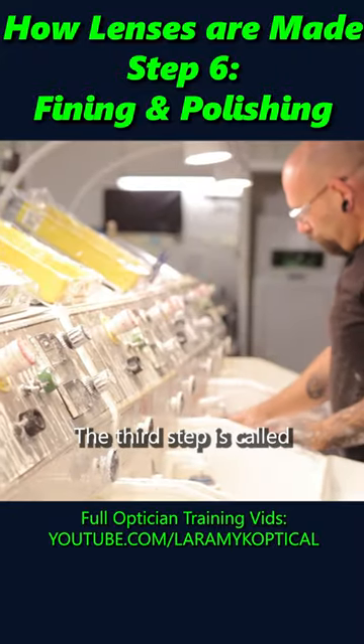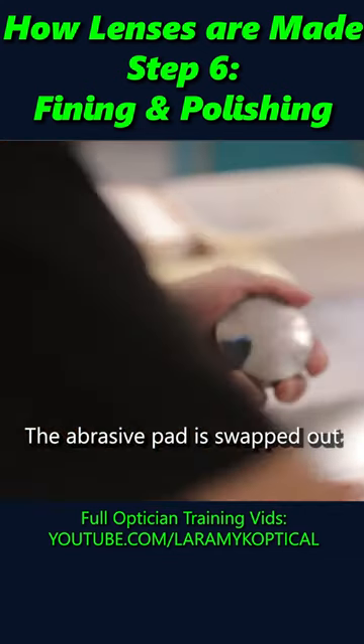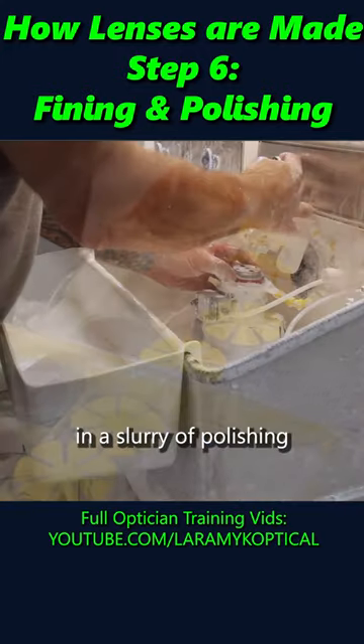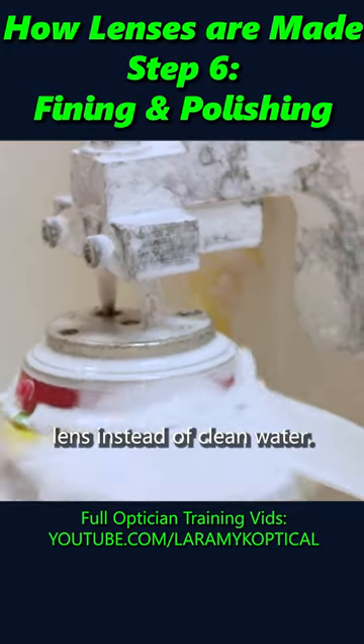The third step is called polishing and works the same as fining. The abrasive pad is swapped out for a soft one, and a slurry of polishing compound flows across the lens instead of plain water.